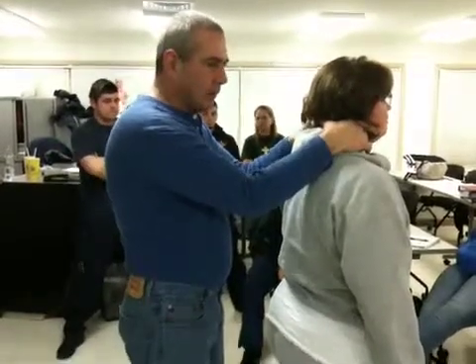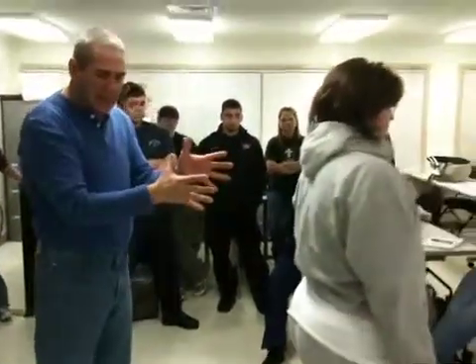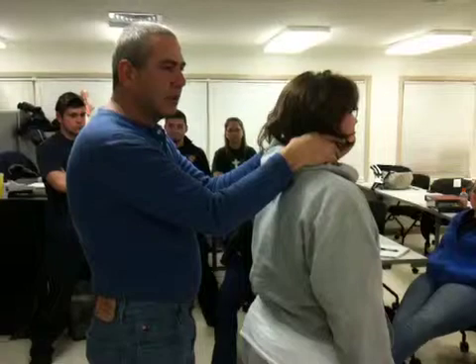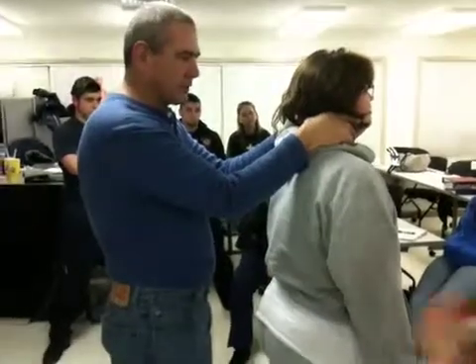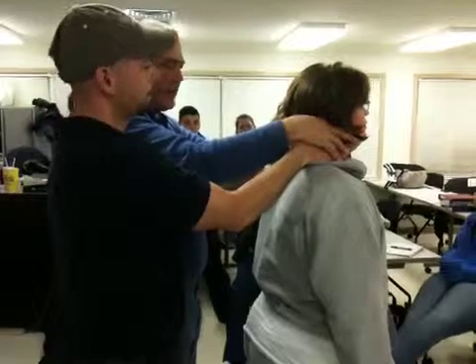All right. Administratively, instead of having C-spine down here, this person's standing up. So I grab here. Now I'm going to give control of C-spine to somebody else. So somebody come up here and take this over. Here's where we're going to put the cervical collar on, just like I've showed you. Put your hand, I roll my hands up, he slides his hands in. You got control of C-spine?